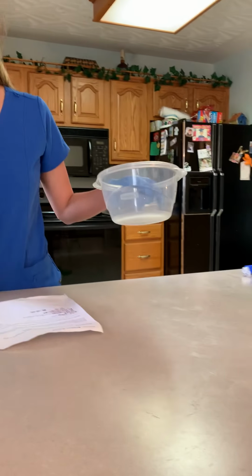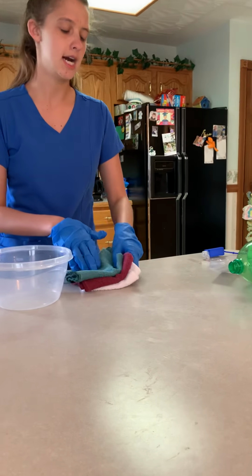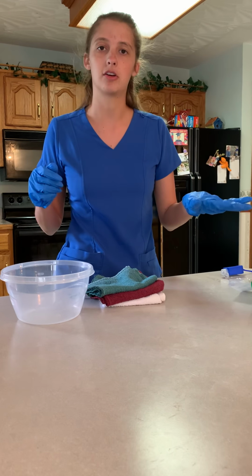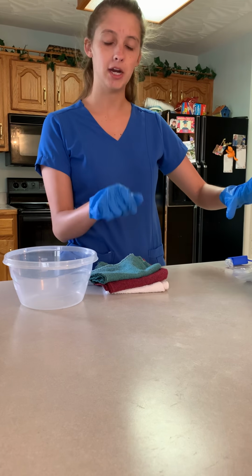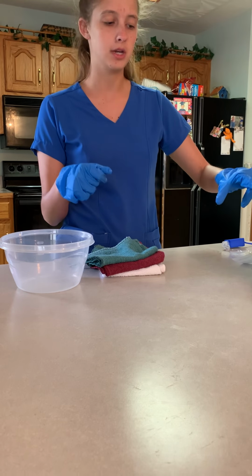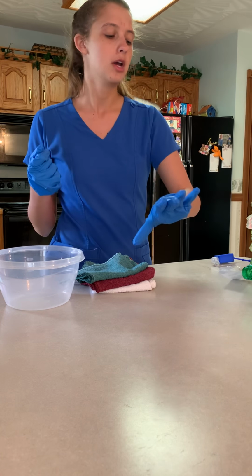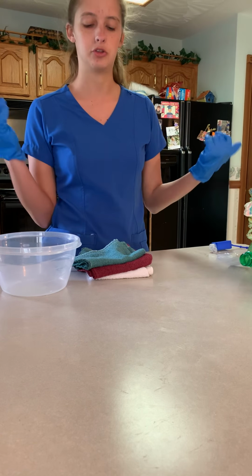So I have my basin full of warm water and soap and my 3 clean towels. If the patient was a male and uncircumcised, we would retract the foreskin back. We would then do our pericare, then do the procedure, the catheterization, and then we would do the pericare at the end. Then we would be able to return the foreskin back to its original position after we did all three.